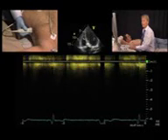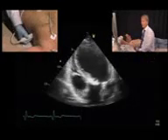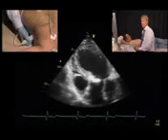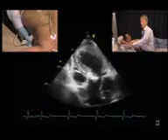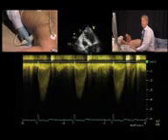Now you can see the spectrum here is not very good, so you can optimize the signal by moving your transducer further lateral, and then you have a much better angle to the ultrasound beam, and you are really parallel. And this way you will usually get much higher gradients than if you use the classical 5-chamber view. And in this case, you also get a much better spectrum.